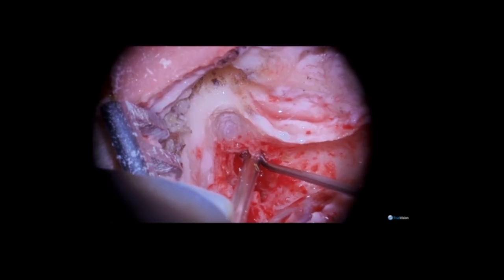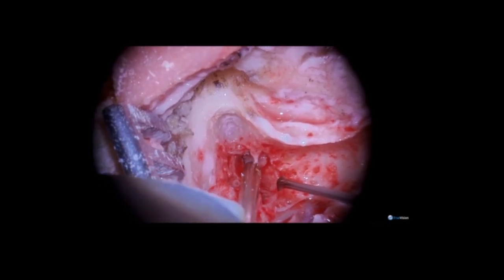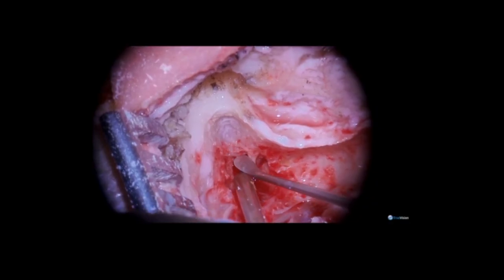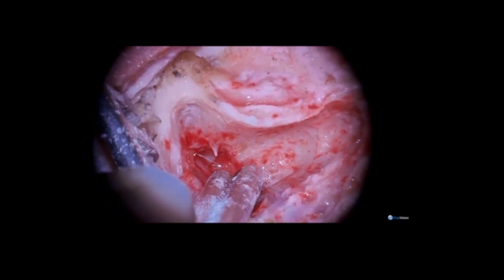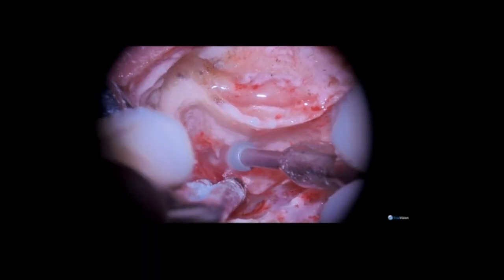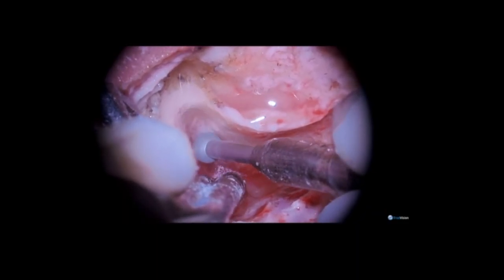Now I am elevating the matrix off of the lateral semicircular canal, which is going to serve as an important landmark for the formation of a good posterior tympanotomy. At this point in the procedure, I'm going to identify the facial nerve, thin the canal wall, and widely open the posterior tympanotomy in order to gain direct access to the incudostapedial joint.